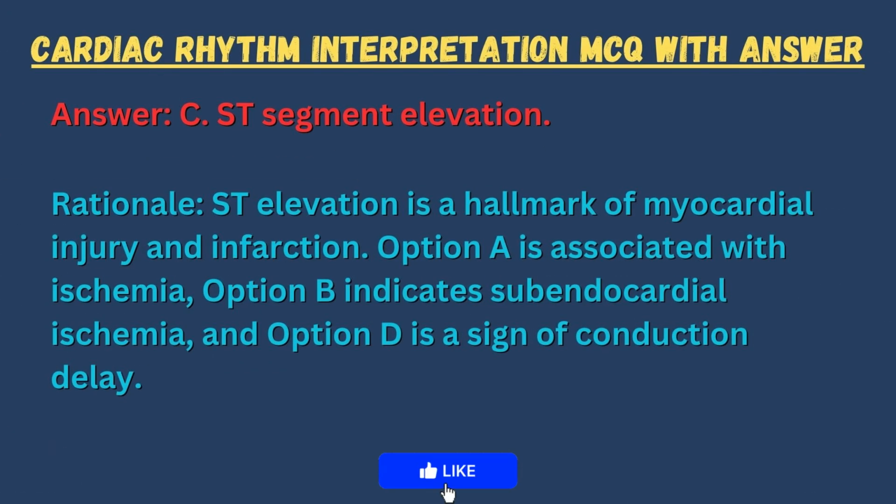Answer: C. ST segment elevation. Rationale: ST elevation is a hallmark of myocardial injury and infarction. Option A is associated with ischemia. Option B indicates subendocardial ischemia. And option D is a sign of conduction delay.